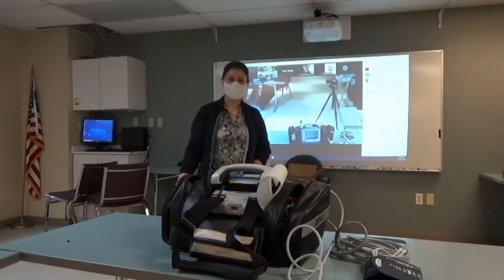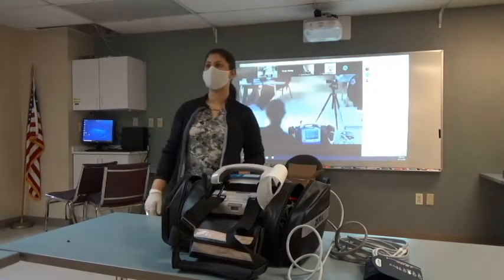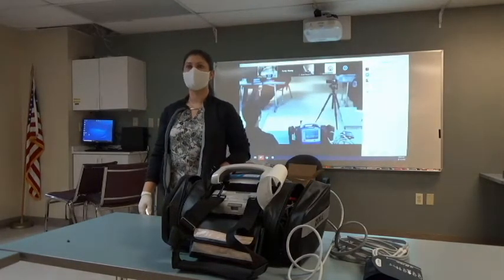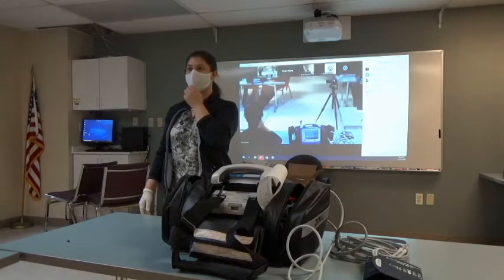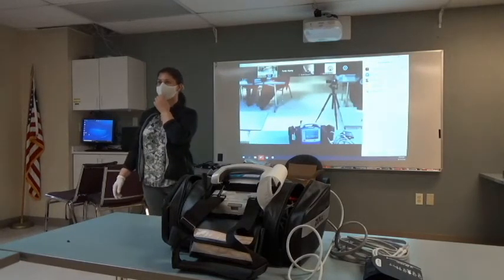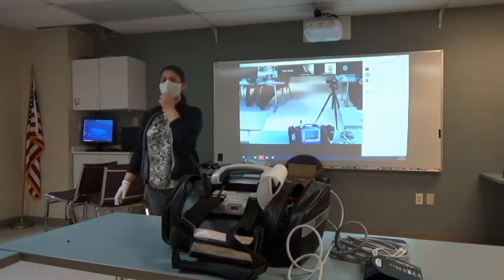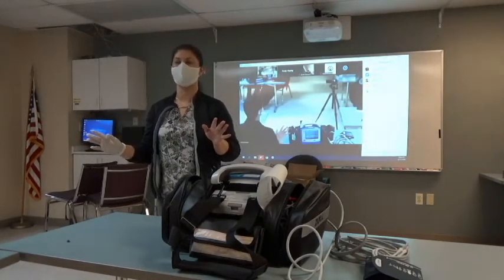Okay, we're gonna move down to the white cross. That white cross is just code markers. There's a total of 10. There's page 1 and page 2. These are all customizable. We put a generic event button in there so you guys could timestamp something quickly if you needed to.